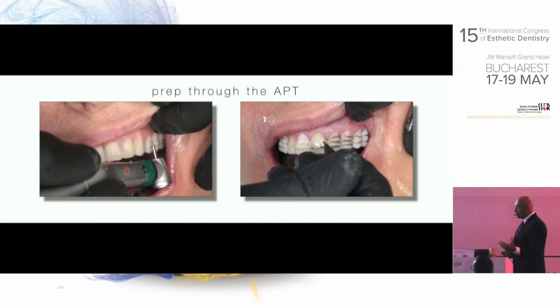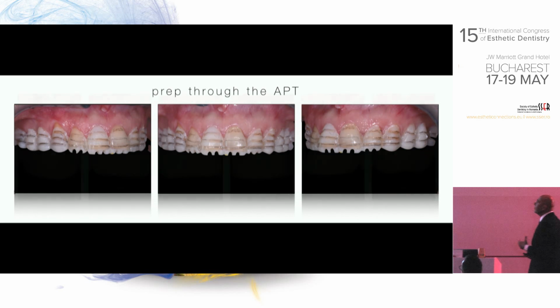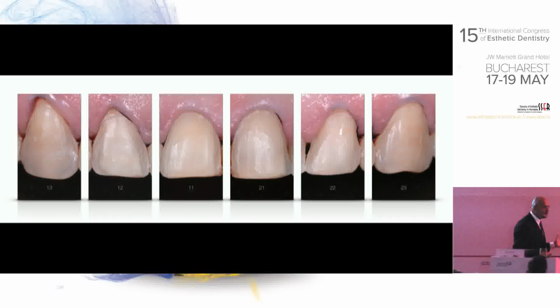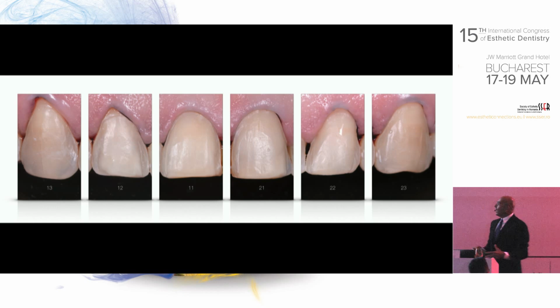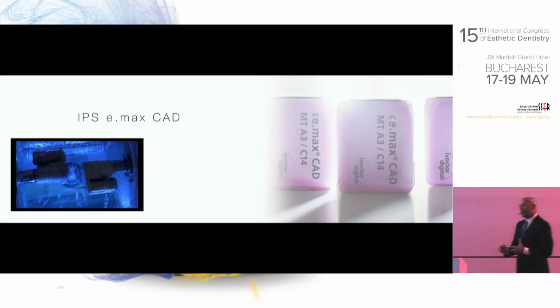Once we have the approval, I'm not getting into details on how to prep through the APT, but in every single tooth, we use it. I don't know, Elif, you were with us when we came out with this idea. By the way, we have great Turkish friends here, and Elif was one of our associates. We worked together for years, and she was in the team when we were developing this APT technique, so thanks again for helping me out with that. And these are the most minimally invasive preps.